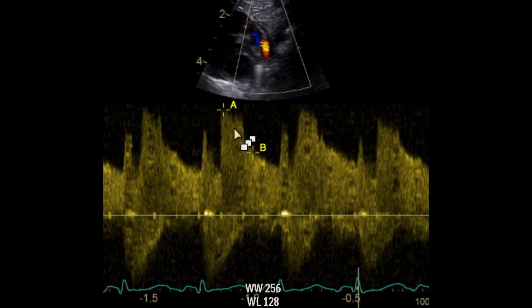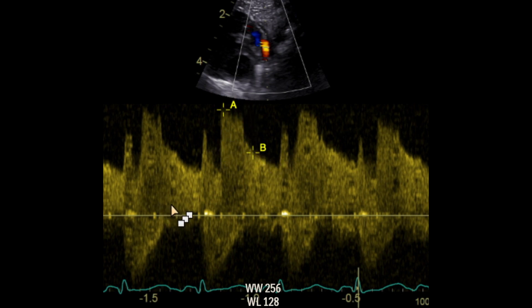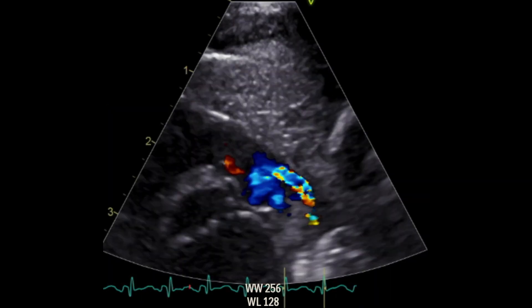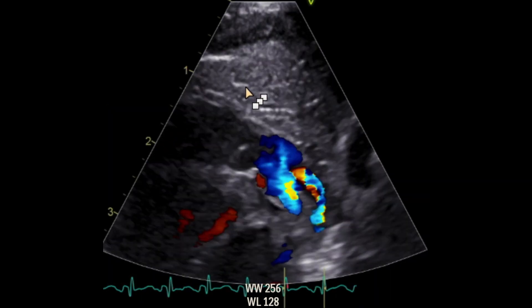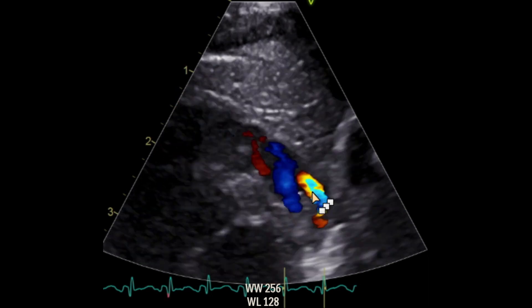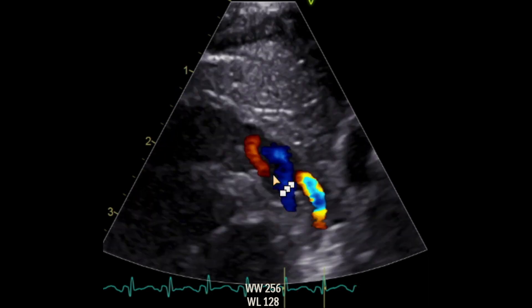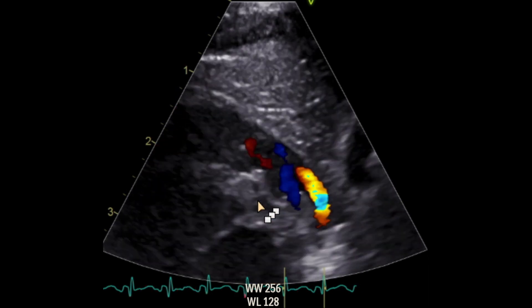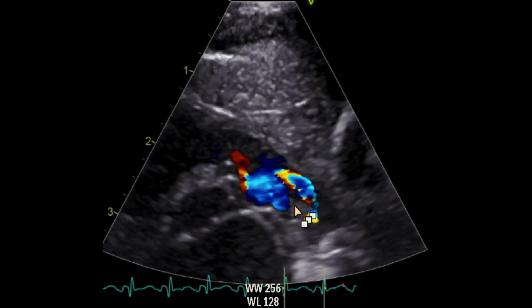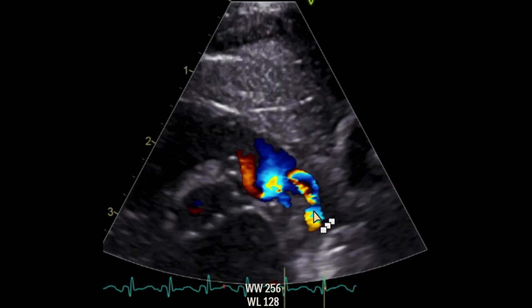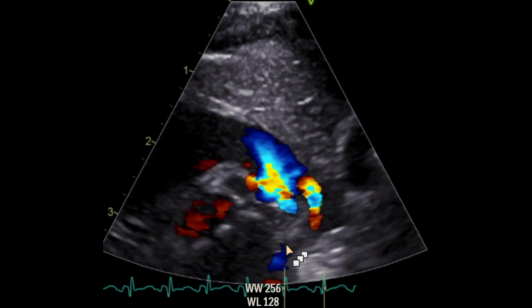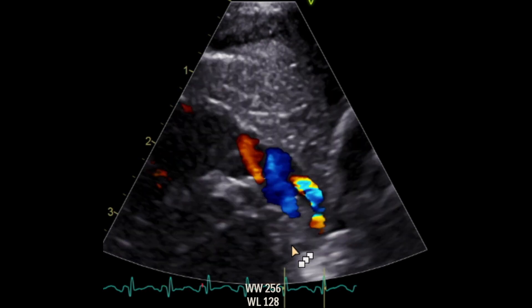This is the flow in the PDA when we Doppler it. This is during systole and this is during diastole. This is left-to-right shunting because it's all above the baseline throughout the cardiac cycle. Again, this is another view of the PDA. You can see the pulmonary artery with the two branches — the RPA and the LPA — and this is the PDA here connecting with the descending aorta.